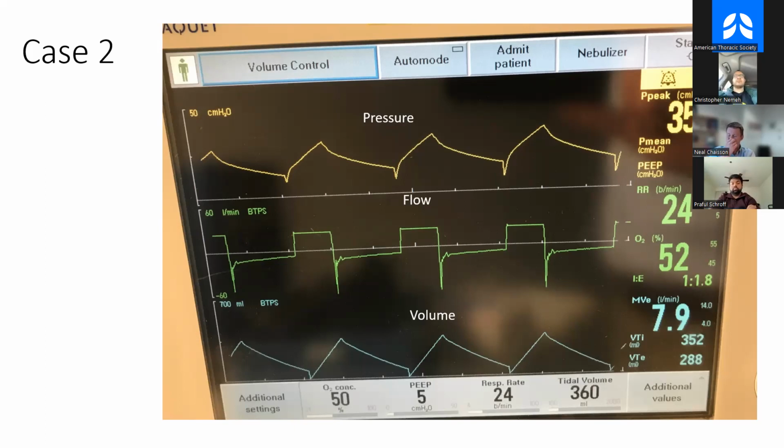So we have this patient here. He comes in, 35-year-old guy, asthma. This is his ventilator, okay? And what I want to ask you is, if you look at the waveforms and you look at the pressures, remember this is the input variables over here. So here's the input variables, right? Down here. So what mode do we have this guy on? What's the monkey responsible for?